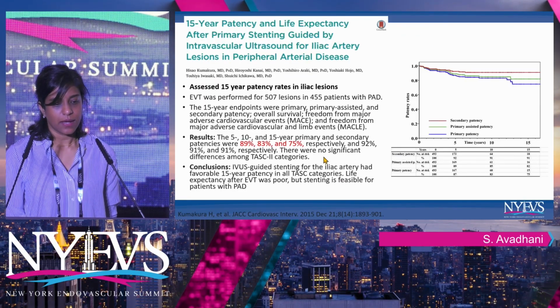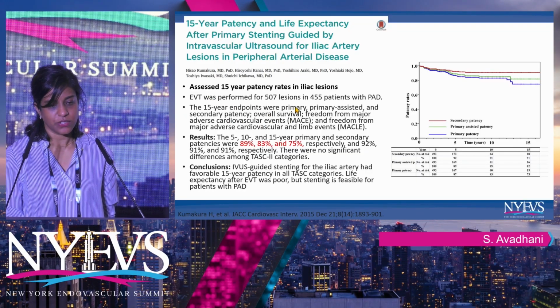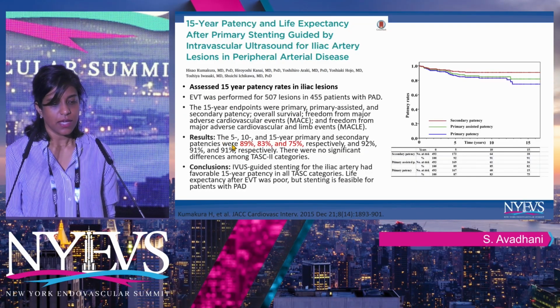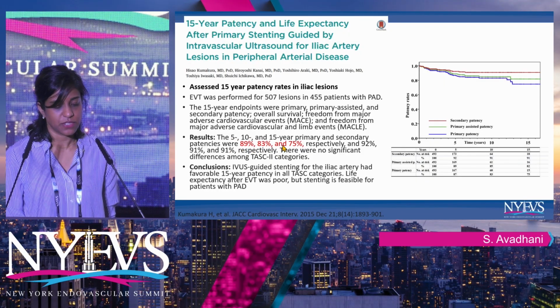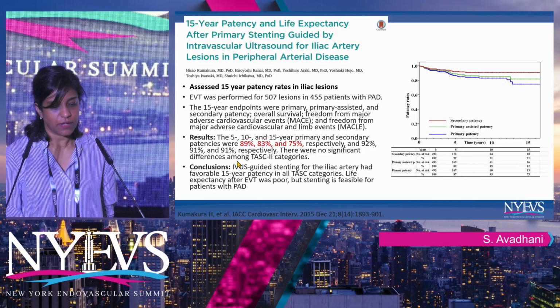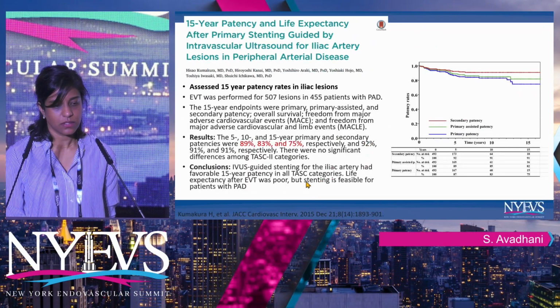used. This one had no comparison group, and followed iliac interventions when IVUS was used, and again reassuring primary and secondary patency rates at even up to 15 years with the use of IVUS, and this was across all TASC categories.